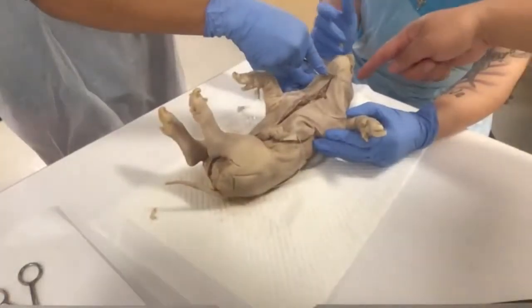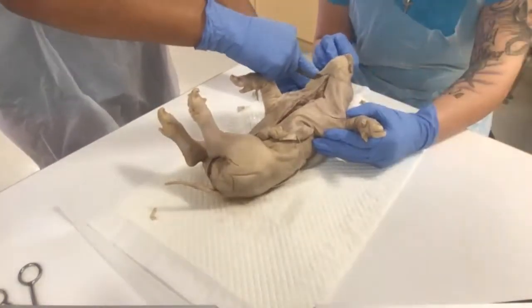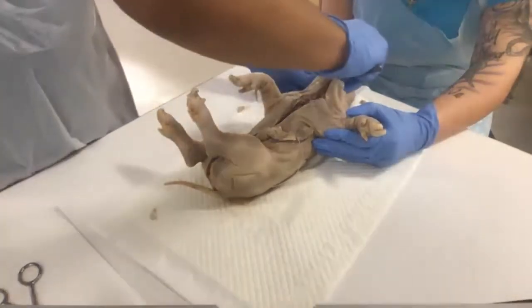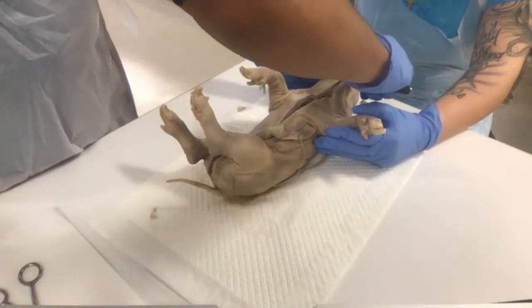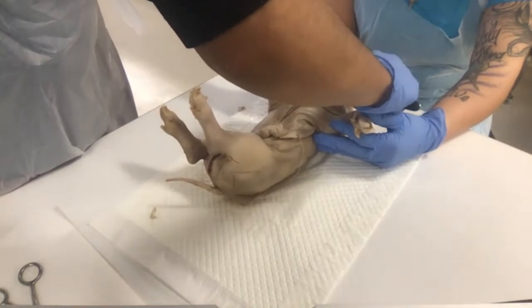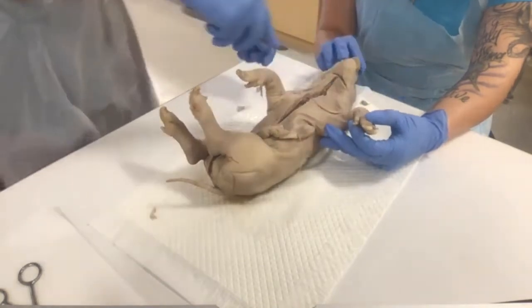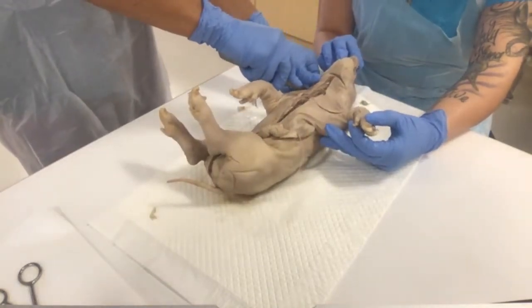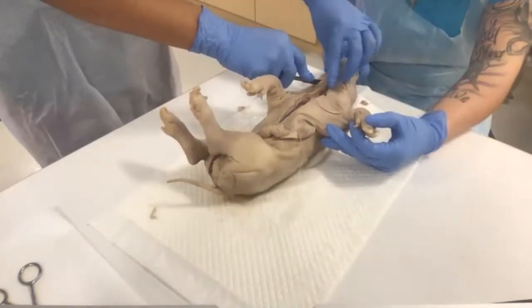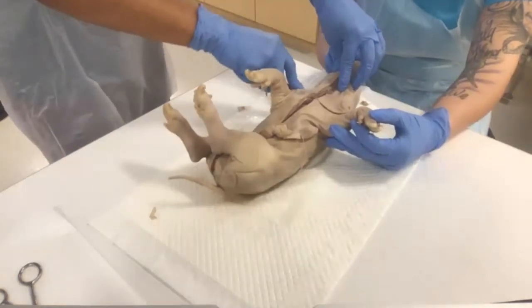Yeah, right underneath the chin, around there, and then, just like the Joker, all the way down, because after you guys switch, then you'll be the surgeon for this upper part, and then you will be the assistant, and we'll round robin that. You can cut more. You can exaggerate all the way down, like to his ears, or to her ears.